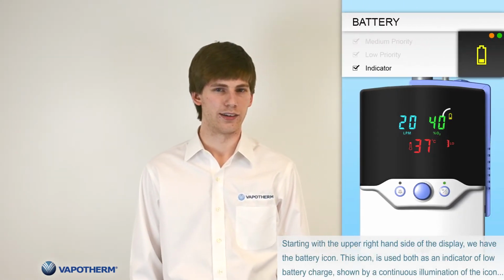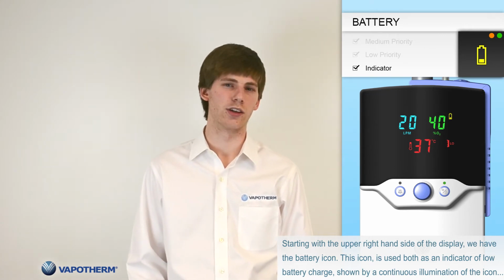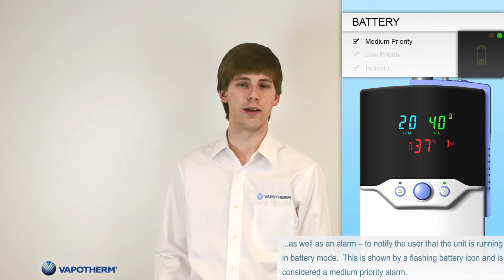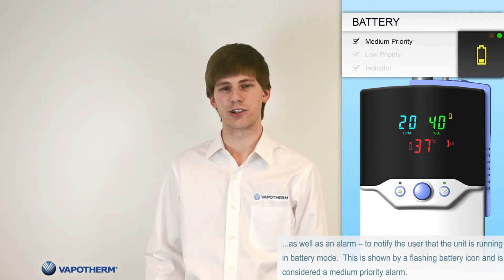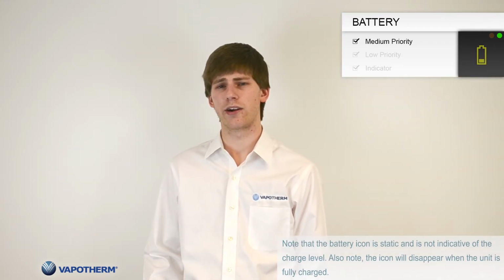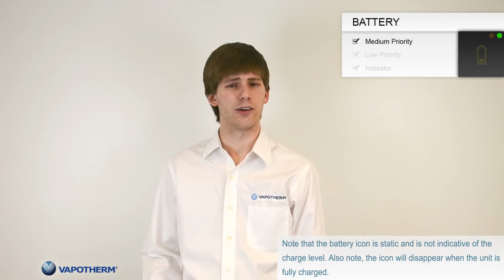Starting with the upper right hand side of the display, we have the battery icon. This icon is used both as an indicator of low charge level, shown by a continuous illumination of the icon, as well as an alarm to notify the user that the unit is running in battery mode. This is shown by a flashing battery icon and is considered a medium priority alarm. Note that the battery icon is static and is not indicative of charge level. Also note that the icon will disappear when the unit is fully charged.